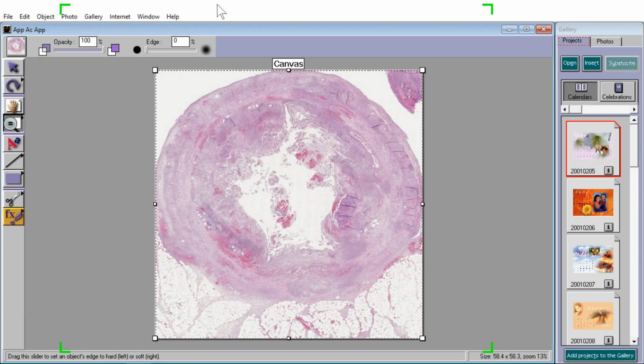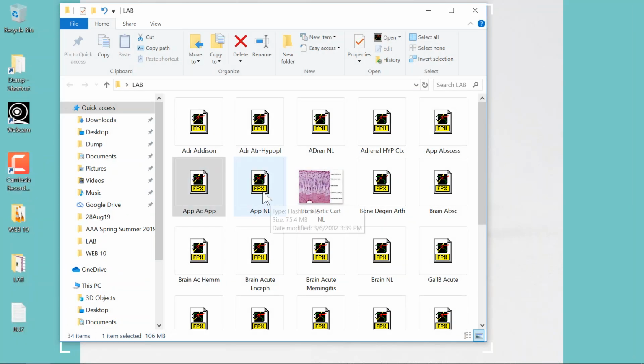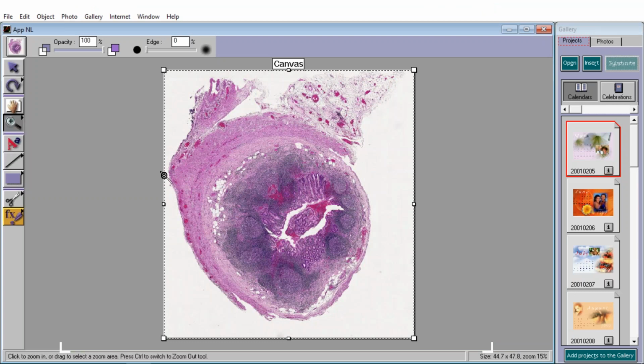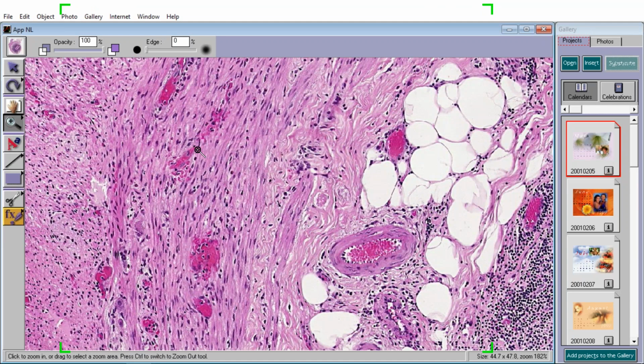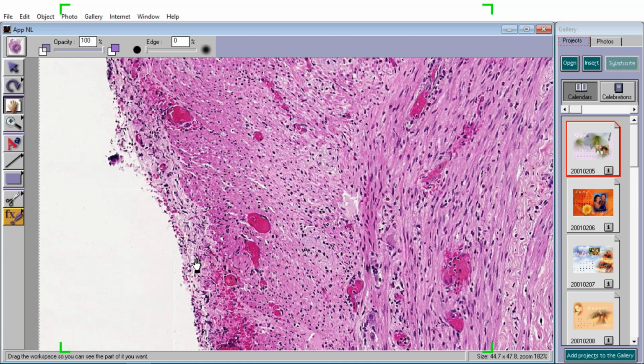Yeah, let's go back to the one that we called normal, okay? Because it's going to demonstrate a principle. This is the one that we called normal. And we're going to go back, and you can see that in this case, the smooth muscle layers were not infiltrated by any type of cell. They're just normal smooth muscle cells. But we did comment that some of the blood vessels in the serosa looked like they were a little congested or hyperemic. So could you say that maybe there might have been some kind of process going on here where the serosa of the appendix became a little hyperemic?